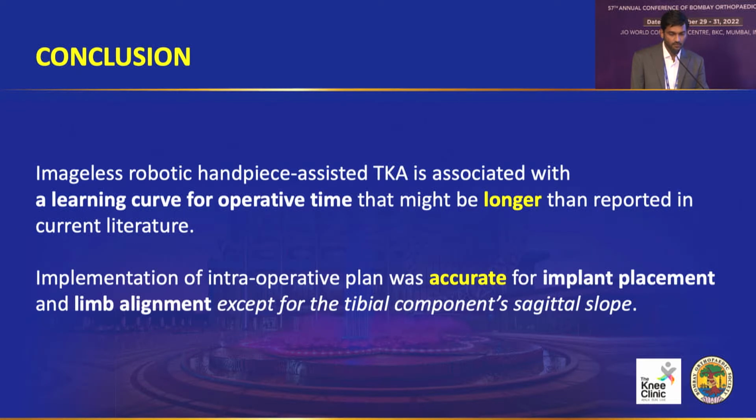So to conclude, the learning curve of course means that you get better at the technology. So from the 16th case, I get faster using it, but it still is slightly longer than reported in current literature. And the system's accurate, except for maybe checking the tibial component sagittal slope. Thank you.